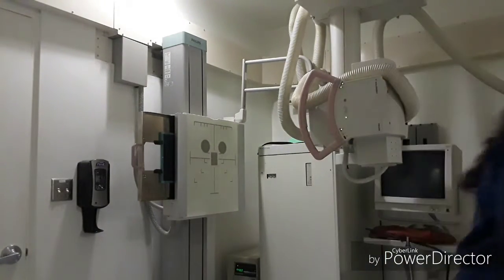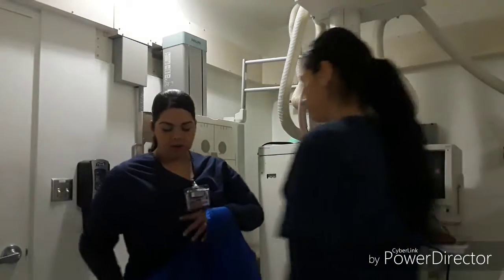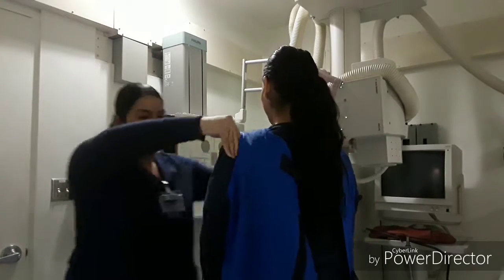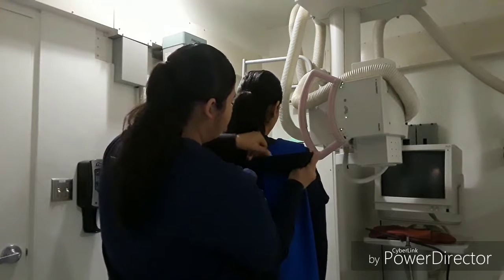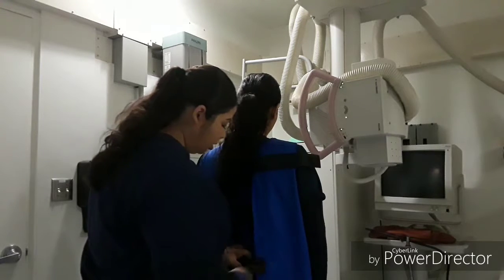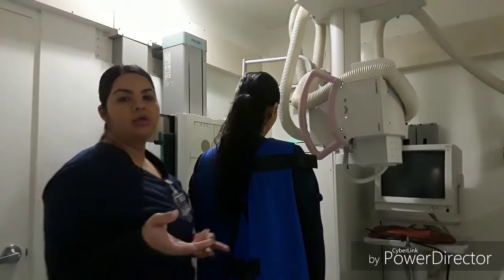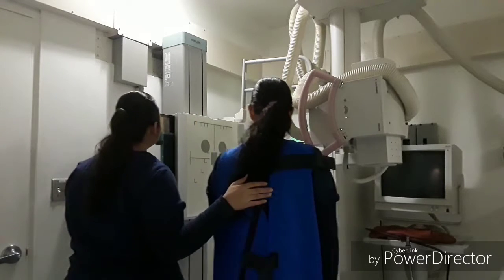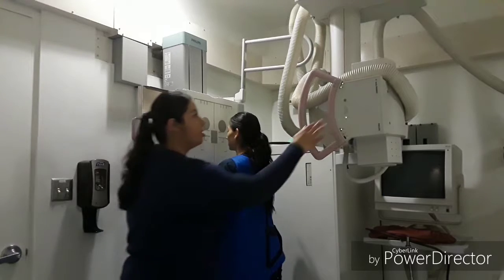Okay, Daisy, come right this way. And I'm going to put this lead on you to protect you from the radiation. It is a bit heavy, I apologize. But I'll try to be as quick as possible. And just let me know if you have any pain or anything. So I'm going to start off with my lateral projection of the paranasal sinuses. Daisy, come right this way. I'm going to check my light.